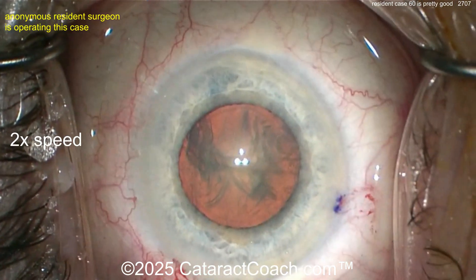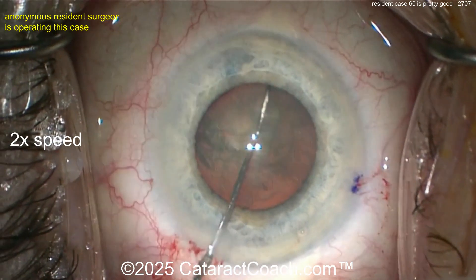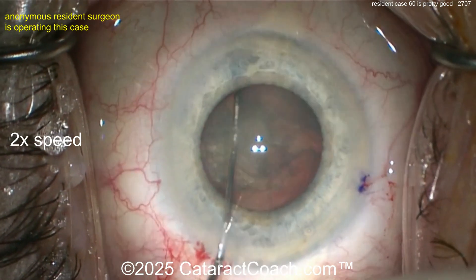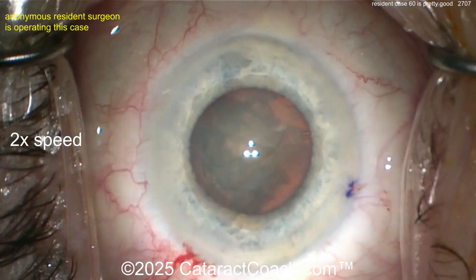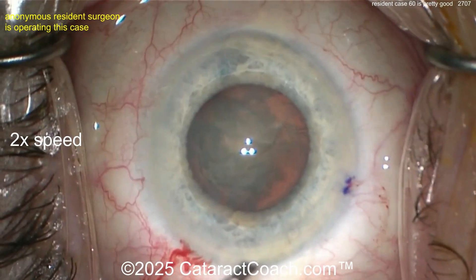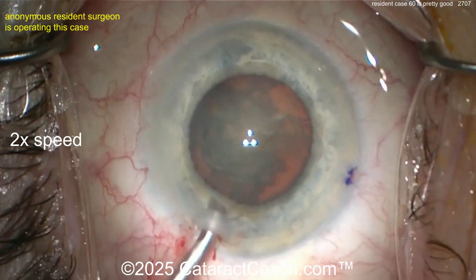Here's a little bit of hydrodissection — nice and easy. Tap the center of the nucleus. I would check to make sure it spins first. Use that instrument, the chopper — check that it spins. You know what I say: if it does not spin, you will not win. But this is spinning and you're going to be winning.